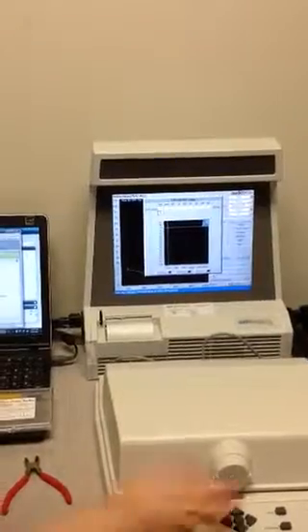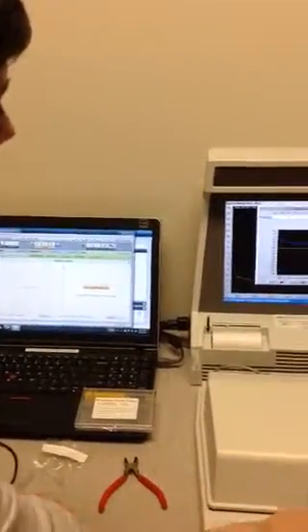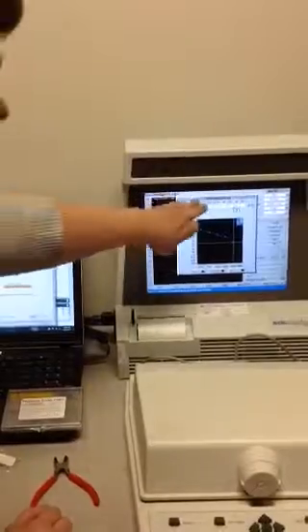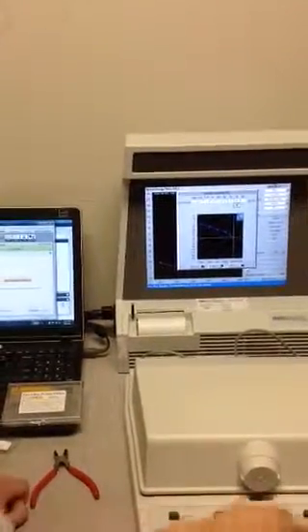So I'm going to give a very basic gradual hearing loss so that this won't be too loud for her because she's got normal hearing. So I'm just starting at normal and just going down by 10 dB. You'll get a copy of this for your assignment.